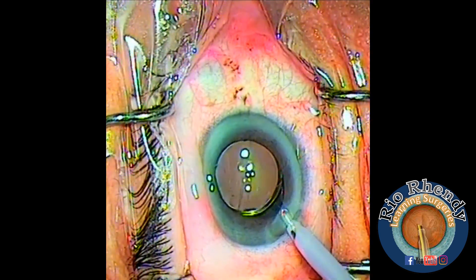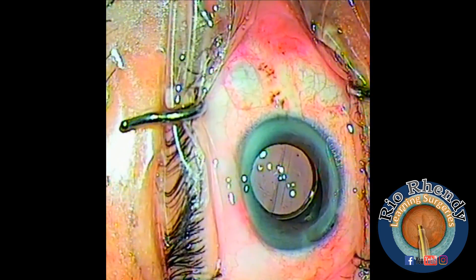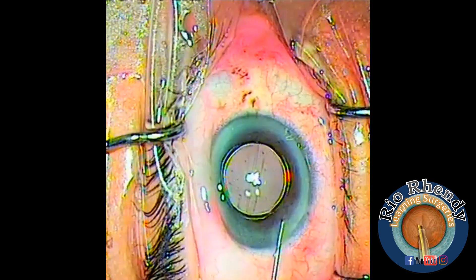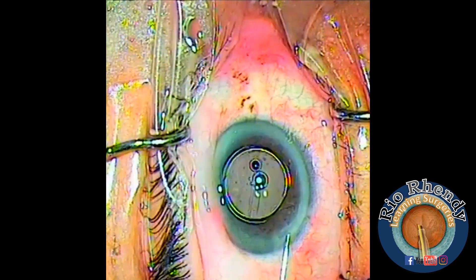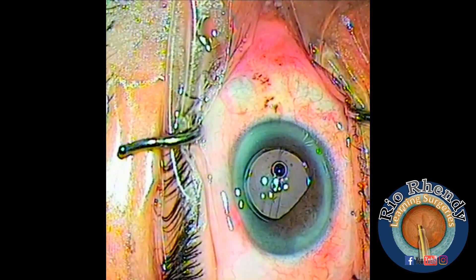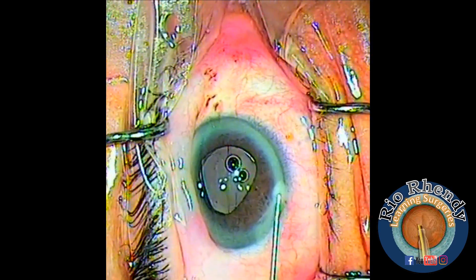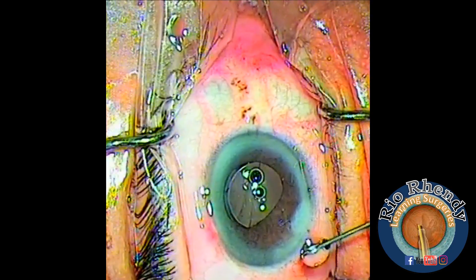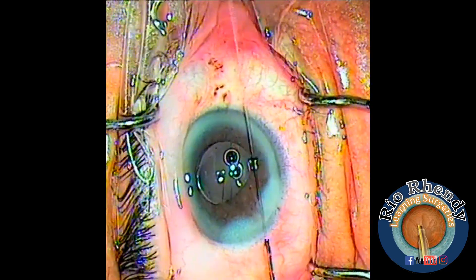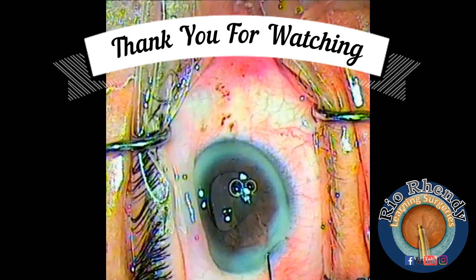Now I put some carbachol to constrict the pupil. Then I put some antibiotics and BSS to hydrate the stroma and close the wound — on both sides and the central wound also. Thank you for your attention, I hope it's useful for you. Goodbye.